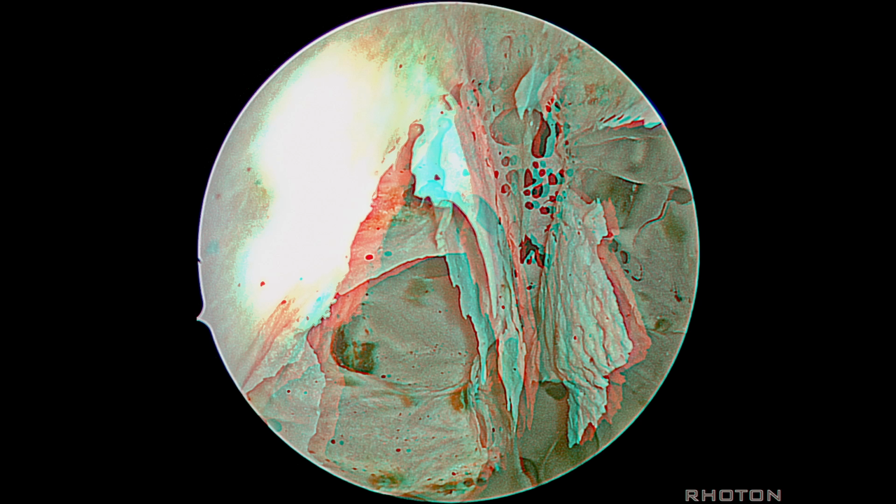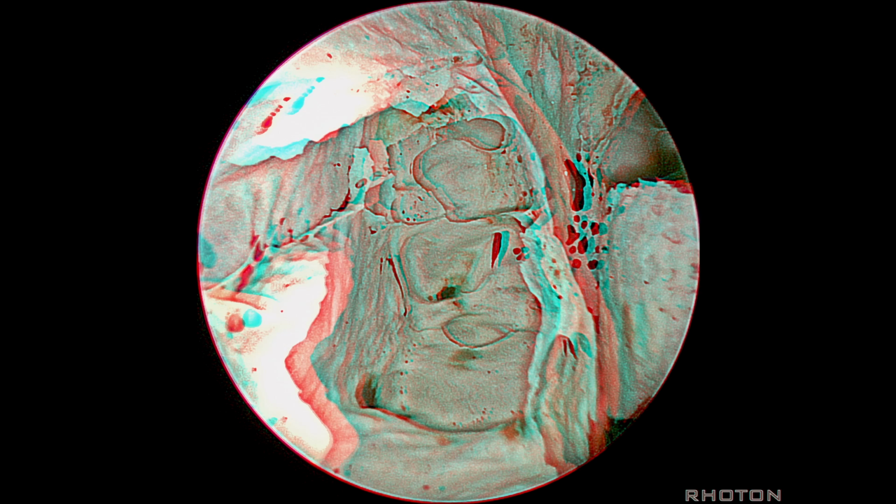And now we see cribriform plate. Here are the ethmoid air cells. And you can work through this complicated maze of ethmoidal air cells. Here's cribriform plate. So by going through that, you see how much on just one side, by opening the ethmoids, how wide an opening you get.